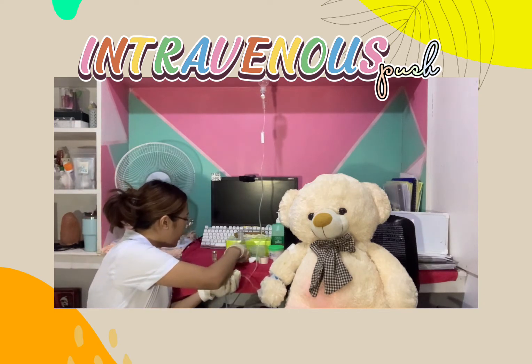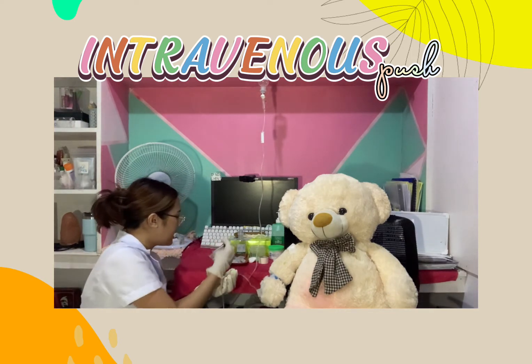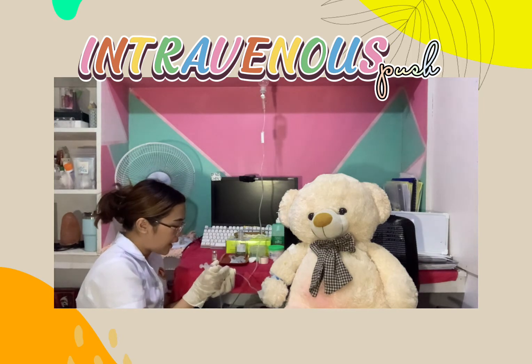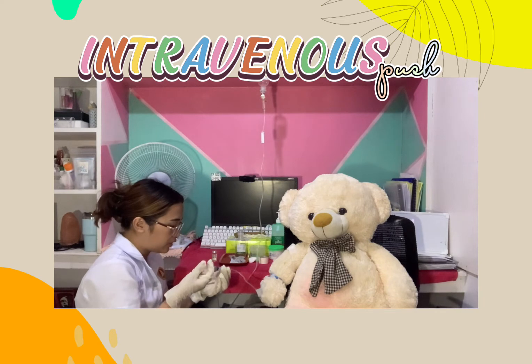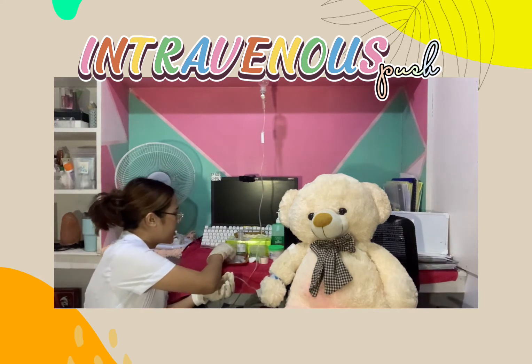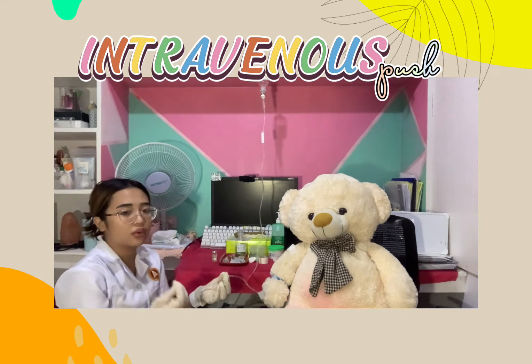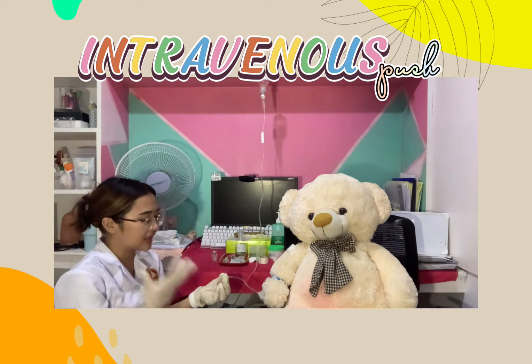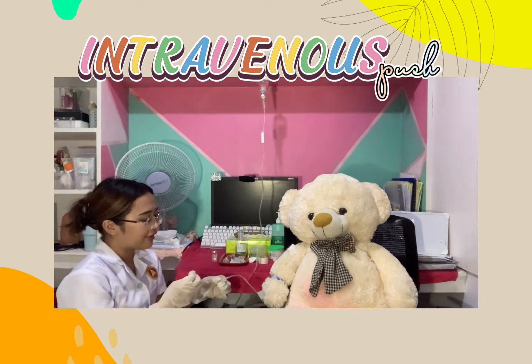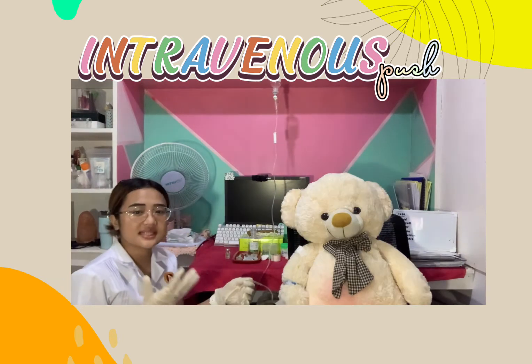And then, we will now put the 1 ml of saline again for the reflushing. So, we will draw it up again, slowly, and then we will remove it. So, you need to make sure that when you are doing it in a central venous line, you can do the push-stop technique.